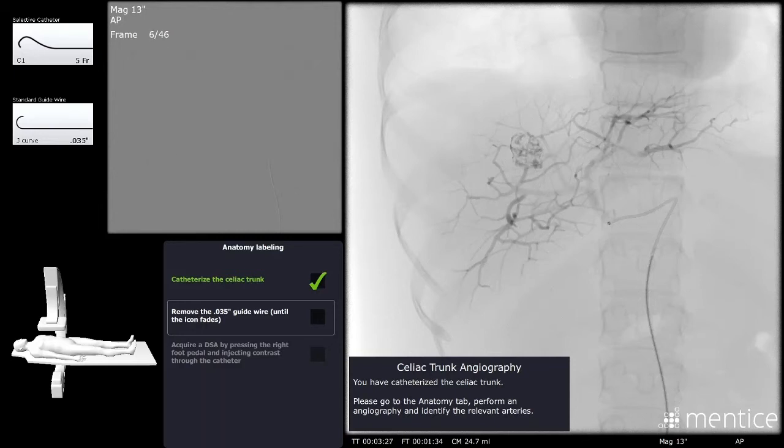So we used to have to do flush angiograms, and with delayed phases to look for portal vein patency when we didn't have as much access to cross-sectional imaging. That probably is not done anymore. And certainly before I get into almost any of these procedures now, I would have some degree of cross-sectional imaging, so that is not really as evident.